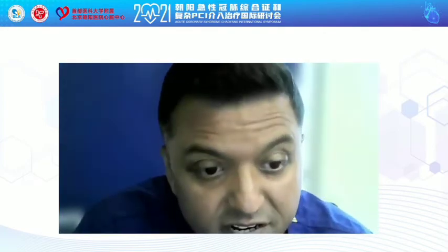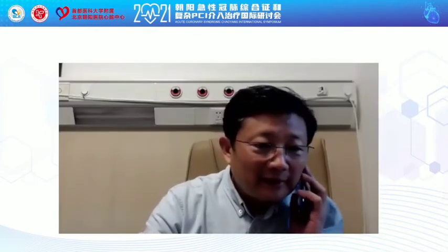Now, I will hold my hands up and be honest and say that I did underestimate that second case, that right coronary lesion. Once it was wired, I felt that maybe it was just more a matter of support, and once you get support, things will evolve quite quickly. But that lesion was so fibrocalcific that, you're right, rotational ablation was really the first most appropriate step, despite the fact that we were able to get just the one balloon across and none of the others.